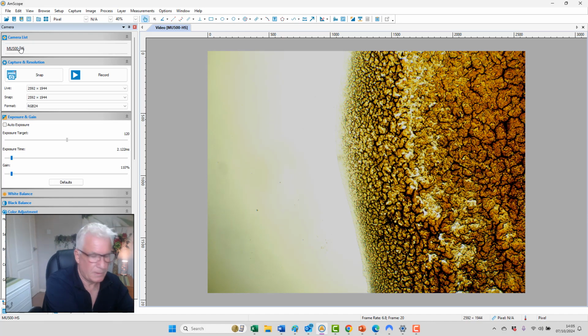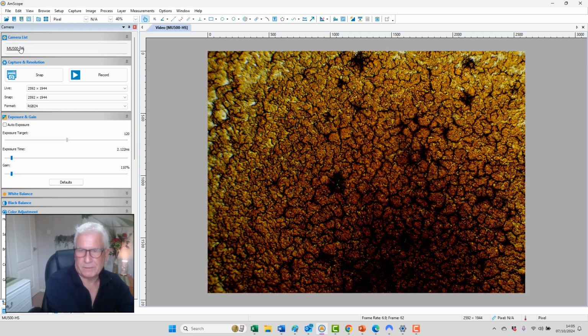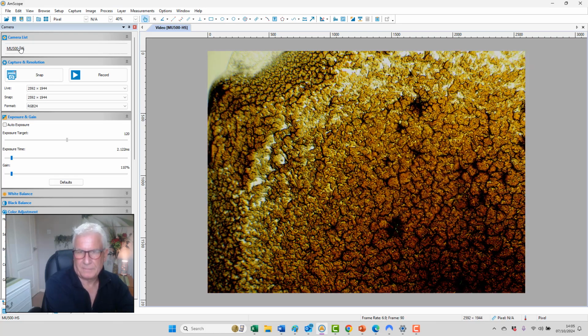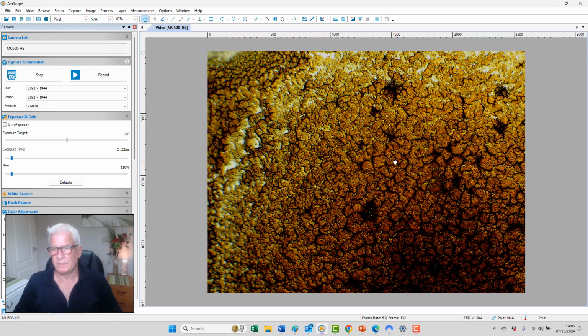Okay. All right. Oh, this person's got parasites to start with. Look at this. See those black bulges there? See these? Look. Okay, they're markers of parasites.